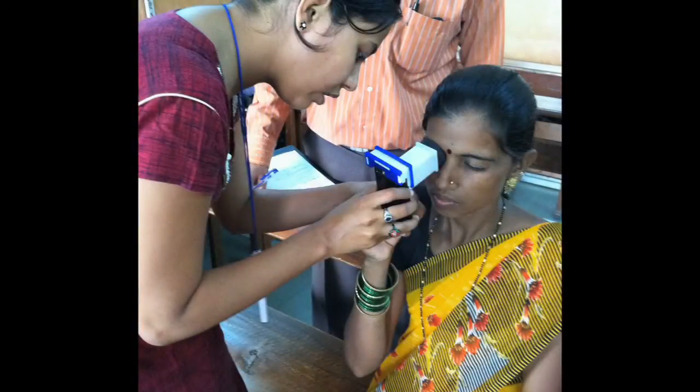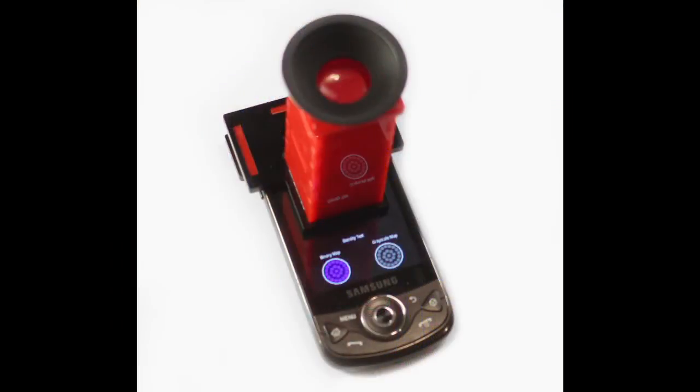In our group, we have started a series of projects for eye care based on portable devices, and we're converting mass-use portable devices into high-end diagnostic medical instruments.